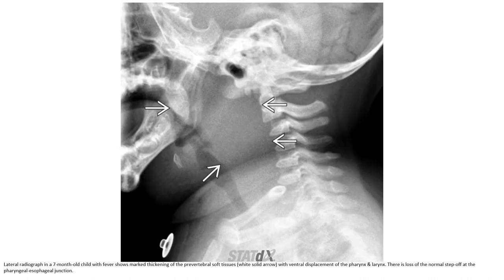This is another seven-month-old patient. There is marked widening of the prevertebral soft tissue. There is loss of the normal stepwise configuration at the cervical level. This is also a case of retropharyngeal space abscess.